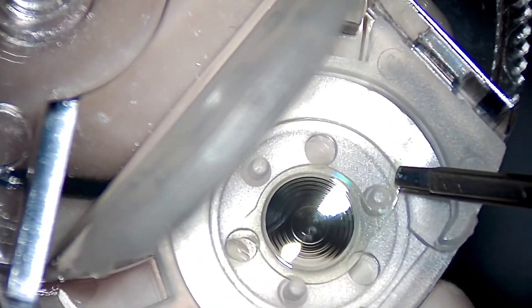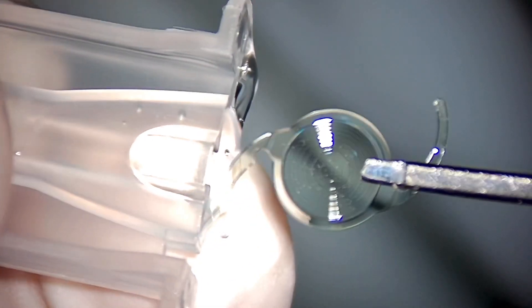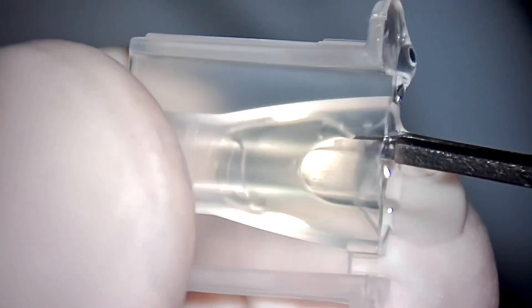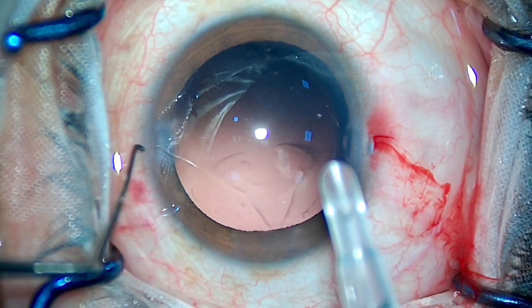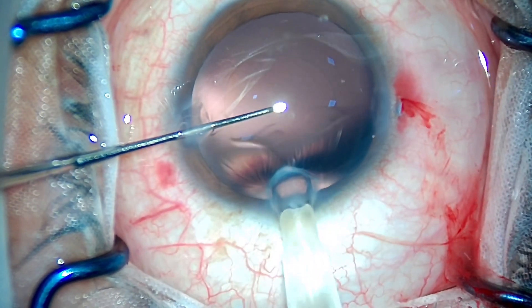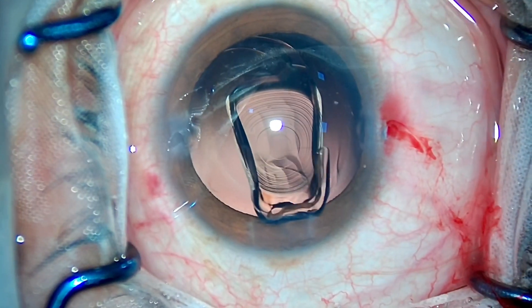You should always take care to pick up the IOL carefully so that it does not slip out of your hand. How I fold it is also important — fold the leading haptic over the optic and the trailing haptic also over the optic, and push it right in. Load the cartridge into the injector and proceed with the implantation of the IOL. Implant the leading haptic inside the bag and dial the trailing haptic gently inside the bag.